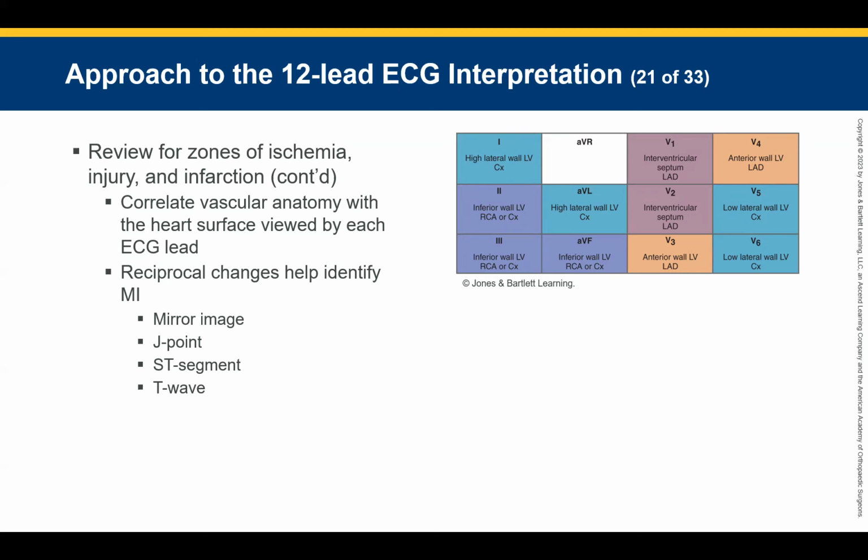Now you're like, well, I don't need to worry about that. That's for the cardiologist. If you activate a bunch of STEMIs and you're wrong, they lose faith in us and they stop actually activating. Have you guys seen that? Where the hospitals don't hard activate, they'll do what they call a soft activation, where the ER doc's like, I'll check it out. Page him, but tell him to stand by. They slow play. You work at a hospital. They do it. We had that relationship with one of our hospitals. It was a problem. And we started really honing down on what is a STEMI, what is a STEMI mimic.